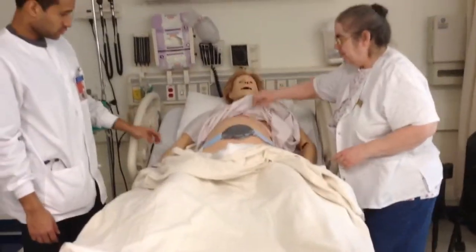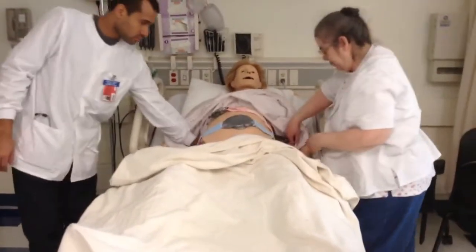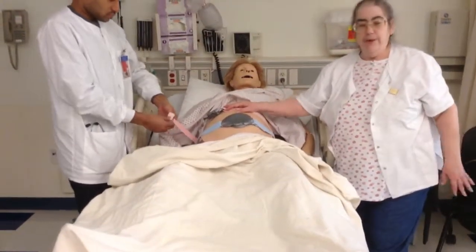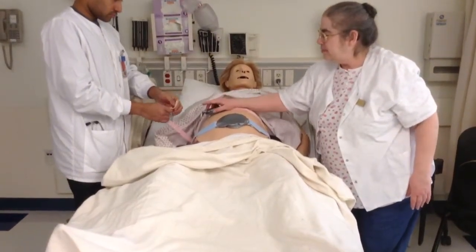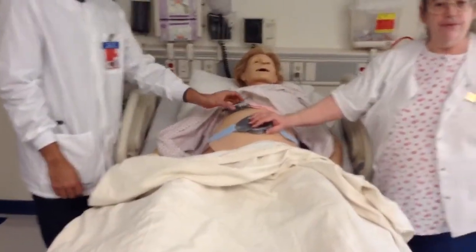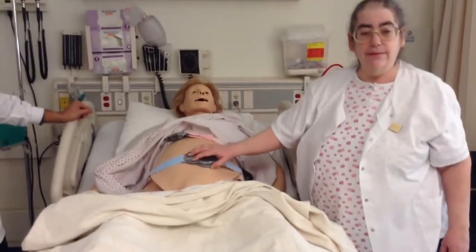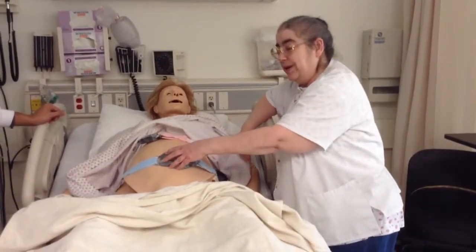Patient first comes in. Patient comes in, they usually put on an external monitor. There's no way to connect it between the two. We are placed on two external monitors. The first monitor is the one that's going to be on the baby. It's an ultrasound monitor, basically, that works the way ultrasound does, the way radar does.